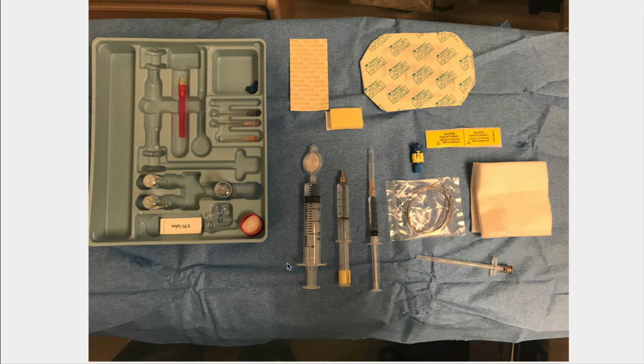But I've found that with muscle memory, if you open up your kit, you familiarize yourself with what's inside it, and you set everything up the same way every single time, you know exactly what you're reaching for, when to reach for it, and it really facilitates placing epidurals easily.